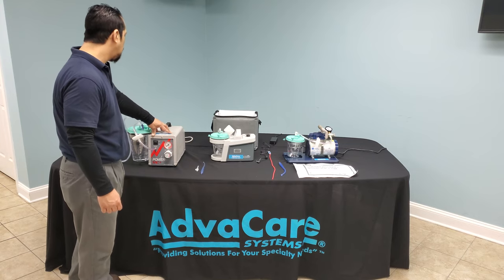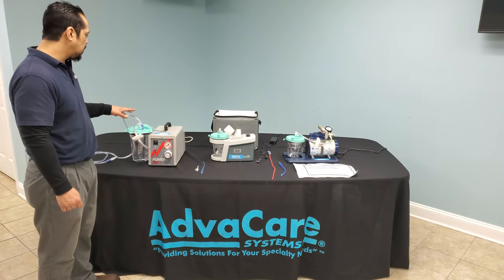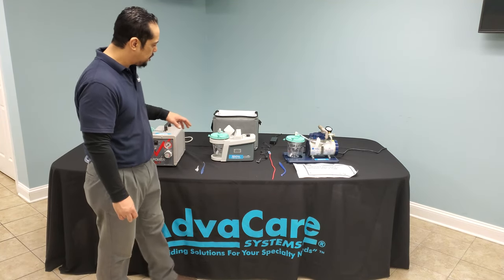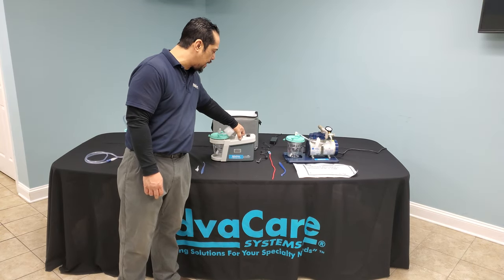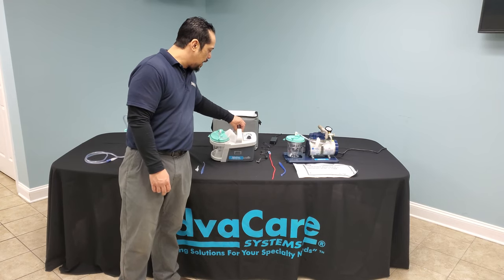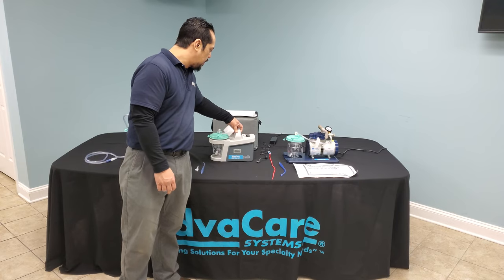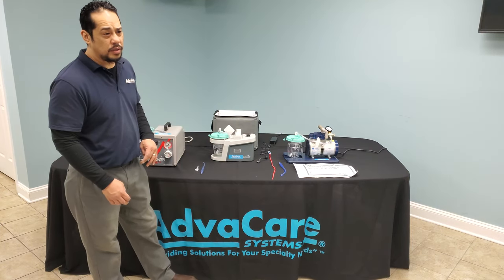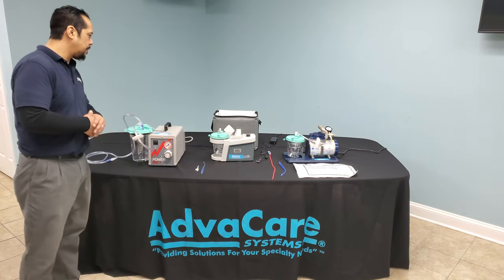Keep in mind all of these machines are powered by electrical power and will need to be plugged into a grounded electrical outlet for proper and safe function. The portable suction machine is battery operated and will need to be recharged to sustain a fully charged battery. On a fully charged battery, it may last up to two hours of suction therapy operation.